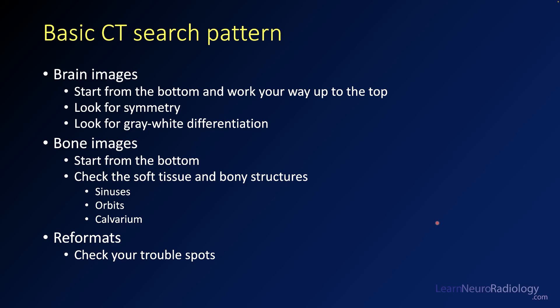When looking at a CT, I tend to start at the bottom and work my way to the top. Symmetry is your great friend in neuroradiology because the two sides should be similar. We're looking for gray and white differentiation everywhere. Once I've looked at the brain parenchyma, I switch to bone window and again start from the bottom, looking at soft tissue and bony structures, sinuses, orbits, and calvarium. Then I use my coronal and sagittal reformats to check trouble spots. The key is to have a pattern and do it the same way every time.